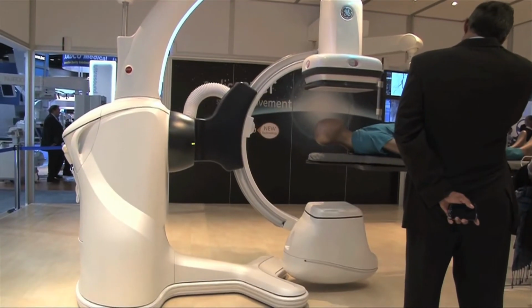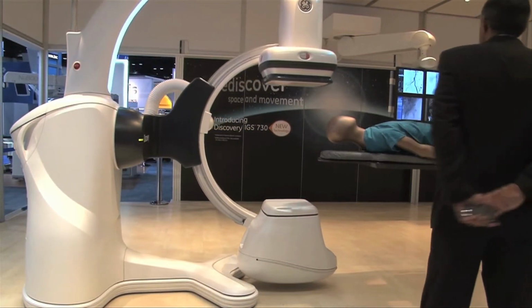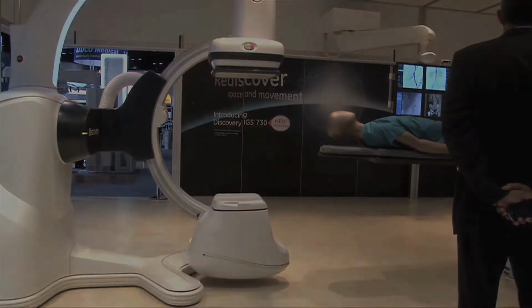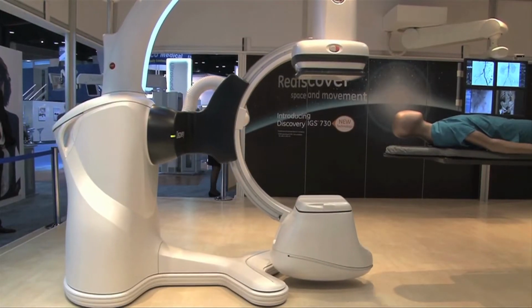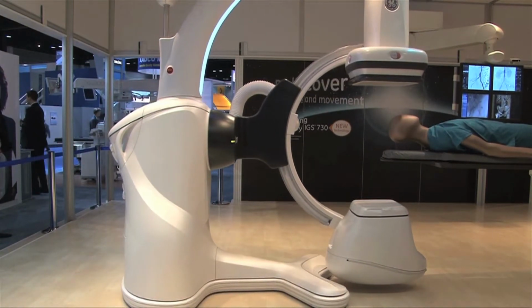Among one of the most interesting product launches that we saw was the GE Discovery angiography system. It is a wheeled mount system that uses laser guidance, so it could actually wheel completely into the corner of a hybrid OR, and then you could wheel it in for an interventional procedure. And the laser guidance allows it to use all of the features that you would normally see on a fixed system, either a floor or ceiling mount, and it offers the flexibility of a mobile C-arm, but with much better image quality. New trends in software include two.